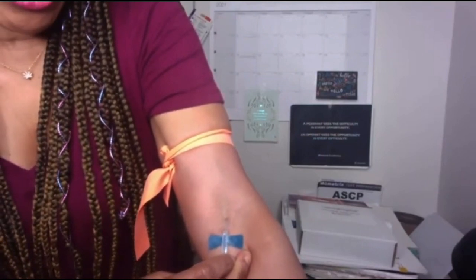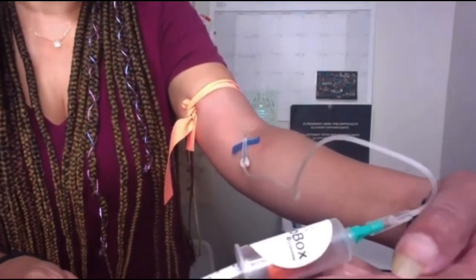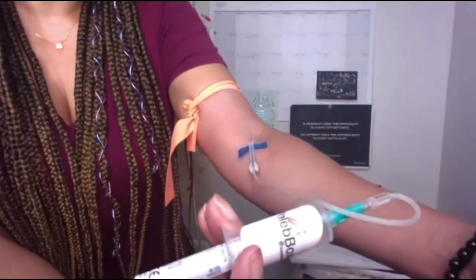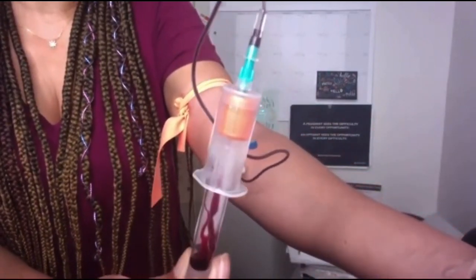That way you start low. You can go in high because you've given yourself room to go up into the vein. Go ahead and puncture your tube. Because we got a flash. Hold your tubes upright. And we have blood.